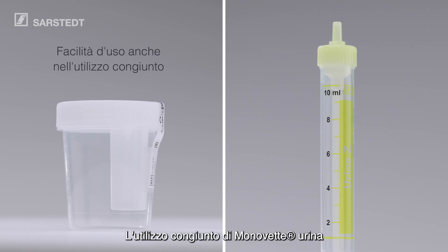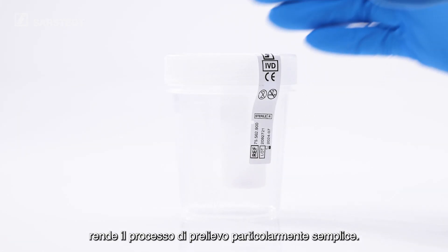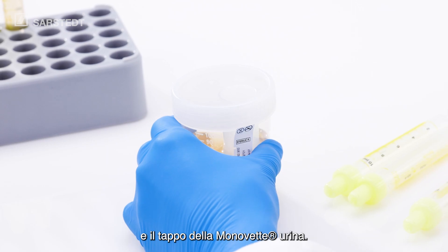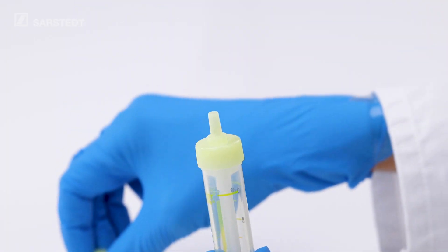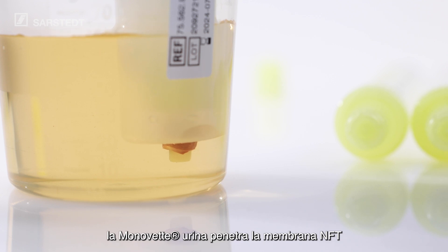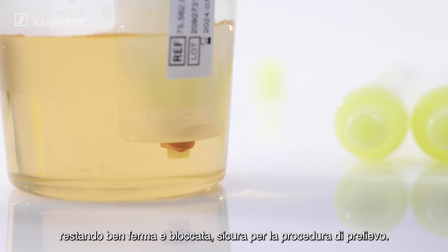The combination of Urine MonoVet and NFT Urine Cup makes the collection process particularly user-friendly. And it's as easy as this. Remove the safety label above the transfer unit and remove the stopper from the Urine MonoVet. Insert the Urine MonoVet into the transfer unit. With slight pressure, the Urine MonoVet penetrates the NFT membrane where it is now securely seated for the collection process.